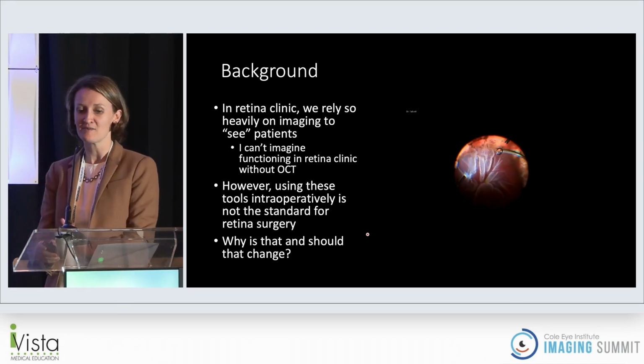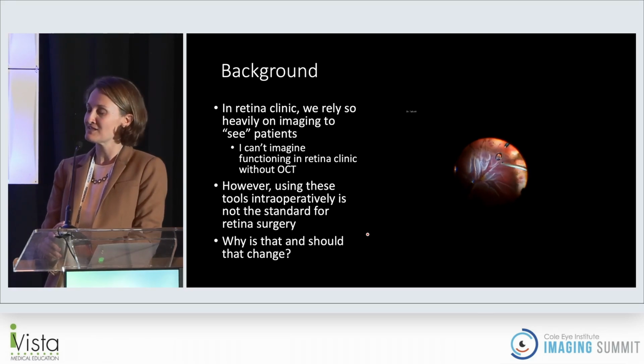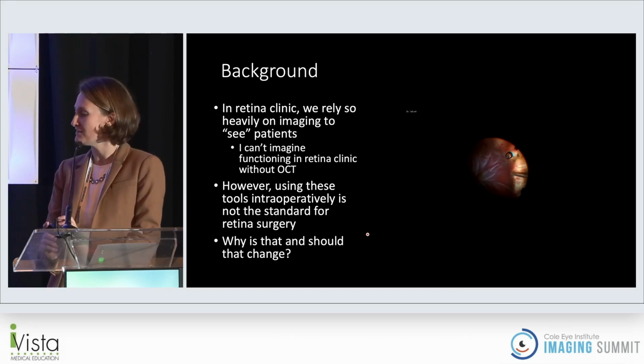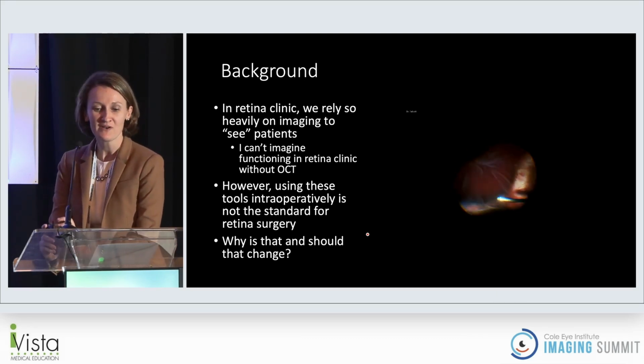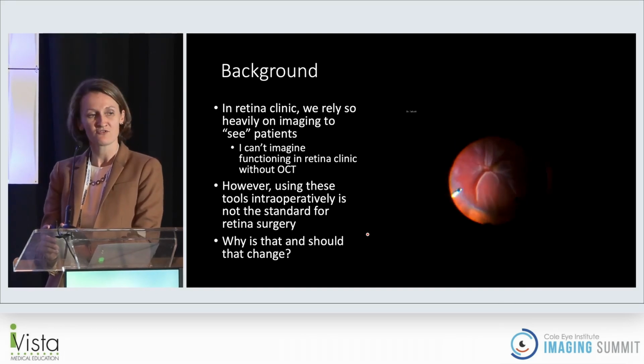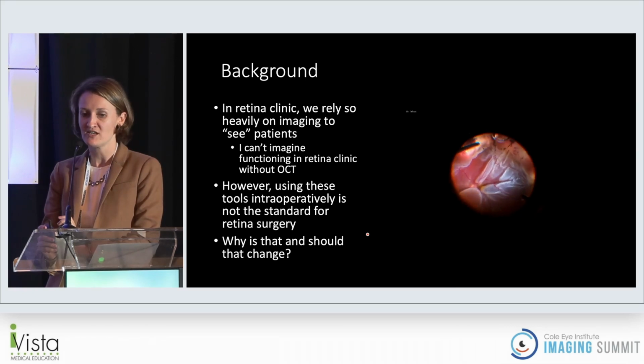I personally can't imagine functioning in a retina clinic without OCT, and although it doesn't happen very much, I kind of feel like we should just pack our bags and call it a day if our OCT server is down. However, using these tools intraoperatively is really not the standard for retina surgery. And why is that, and should that change?